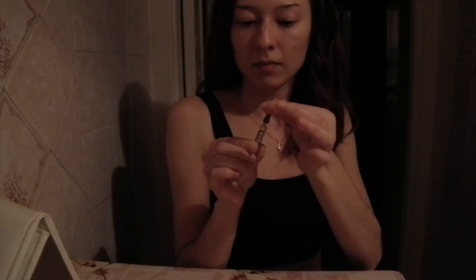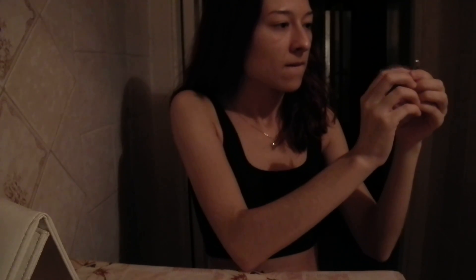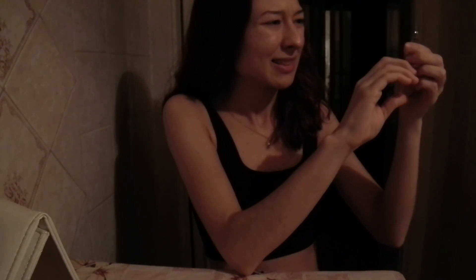You will need your syringe. There's some air in the syringe — you'll need to get that out. You don't want any air in there because it will make the site really painful.